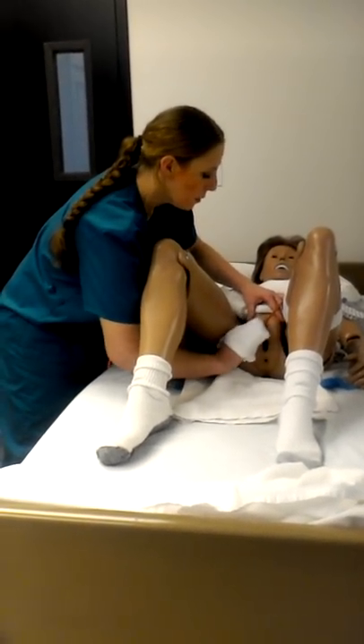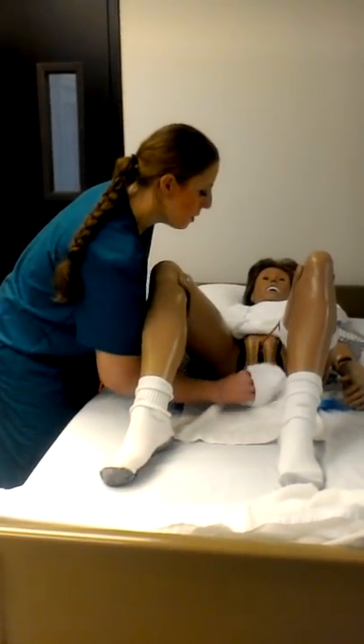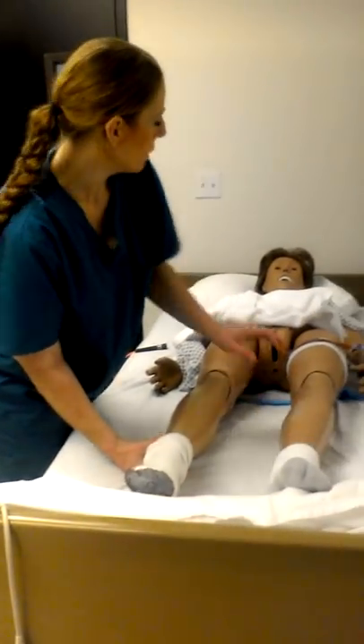Lift. Lift. Lift. Lift. Pat dry. Legs down.